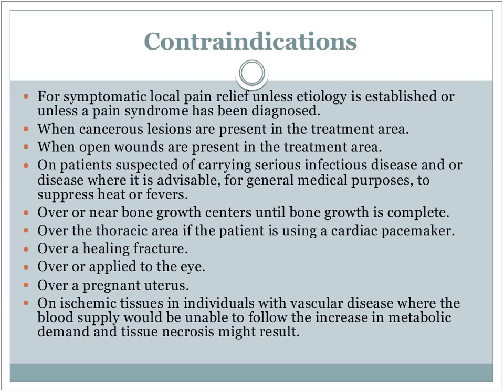Contraindications: this is going to look very similar to the ones from Easton. Don't do things unless you know what the problem is. Cancerous lesions, open wounds, and this just came up recently. There is an ultrasound technique for open wounds, but it's a particular type of ultrasound that I do not believe our units can achieve. And while there is a CPT code for wound ultrasound, we don't have the mechanics to deliver that waveform. So I would say we do not do ultrasound for wounds.